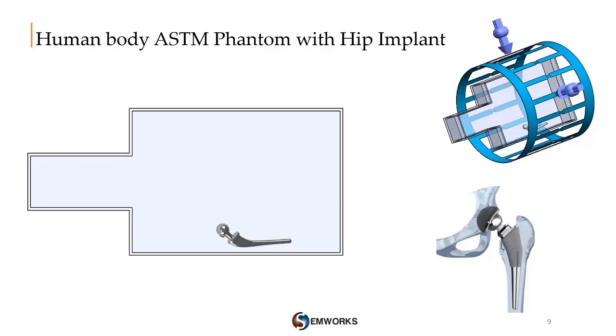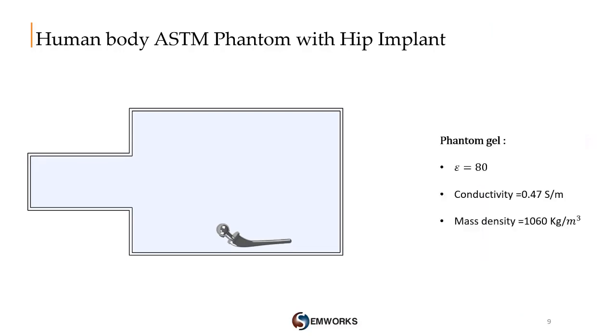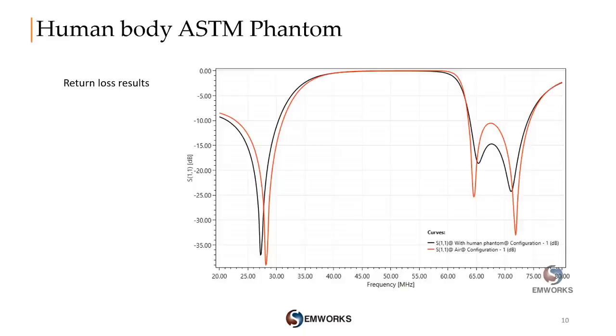The dimensions of the gel phantom used are fixed by ASTM norms and it consists of a plastic container with gelled saline. This gelled saline replaces the human body materials with equivalent material properties. And also we will use a stainless steel hip replacement. Here we have the phantom gel with a permittivity of 80, a conductivity of 0.47 Siemens per meter, and a mass density of around 1060 kg per cubic meter.